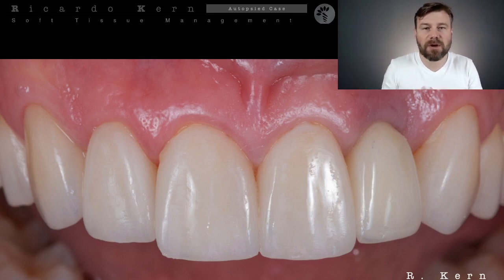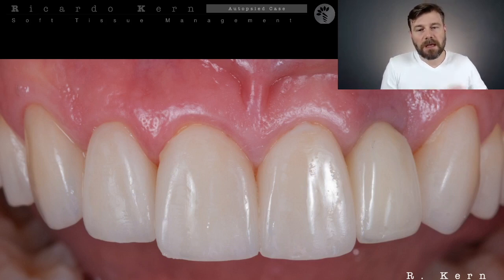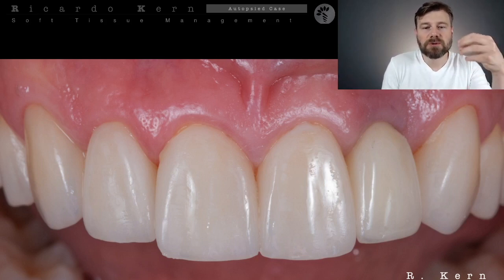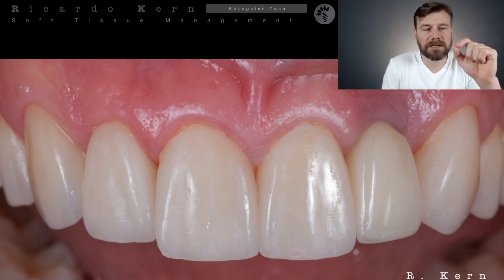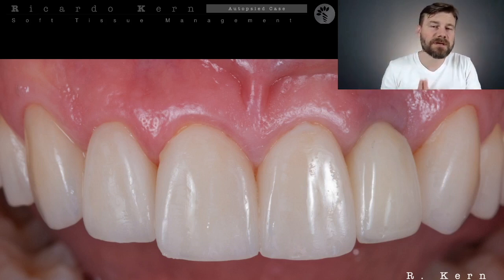In the next case that I'm going to present to you, you're going to see a much more difficult case to handle. And before moving to this implant, I have to point out two things that we need to be concerned about when deciding to treat an implant with soft tissue graft, because there are some situations where I also need to extract the implant. One case is when I have more bone loss around this implant than 3 millimeters.